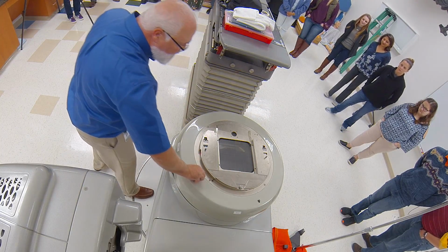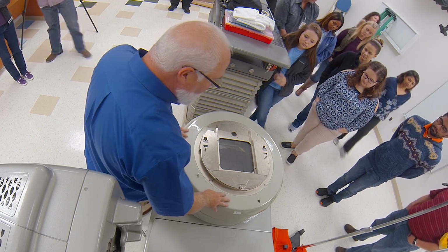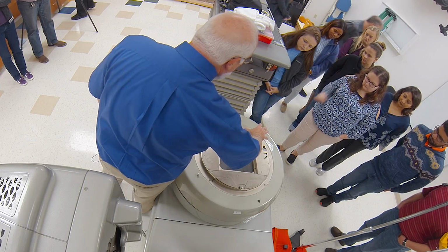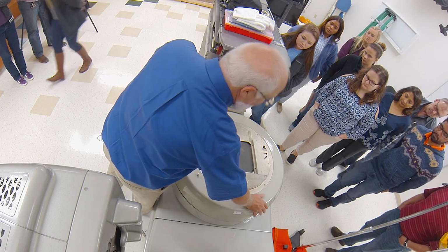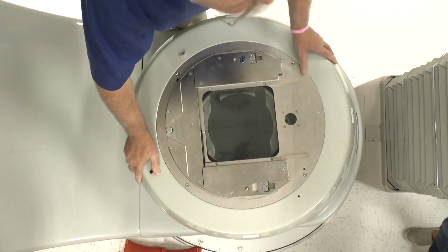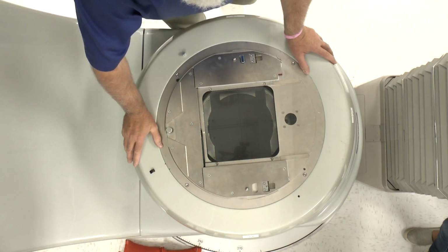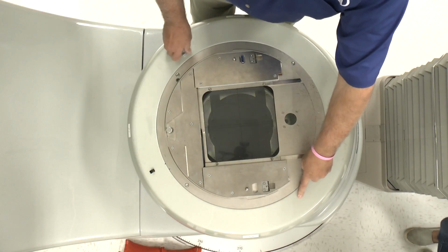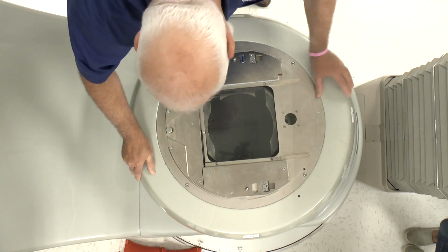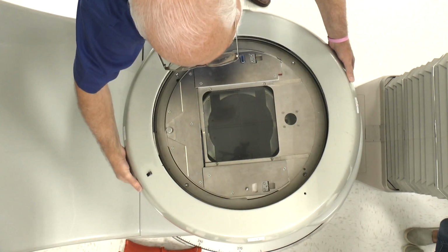Okay, to start off with, your MLC cover will be on. It'll look like this. You have a spring latch and you have two screws. Originally Varian just had this spring latch, and there'll be an Allen screw behind it, so you couldn't activate it. Well, someone didn't get the spring latch on properly, and this cover fell off and hit a patient. So that's why there's now two screws on it. So you'll always make sure that you screw the cover down to the head. And then we still use the spring latch. You rotate it, see how this one has a mark on it? That tells you it's safe to take it off.